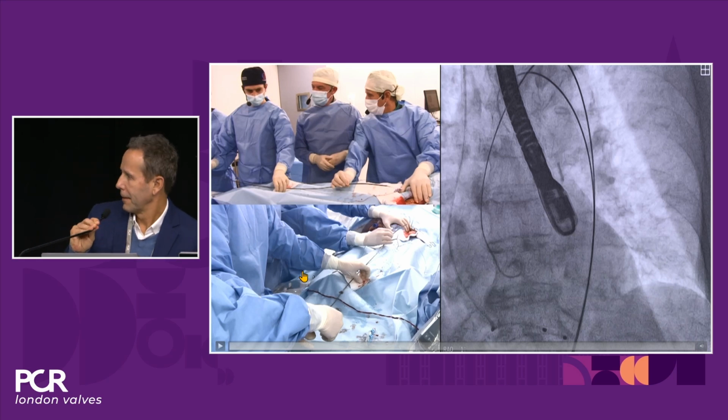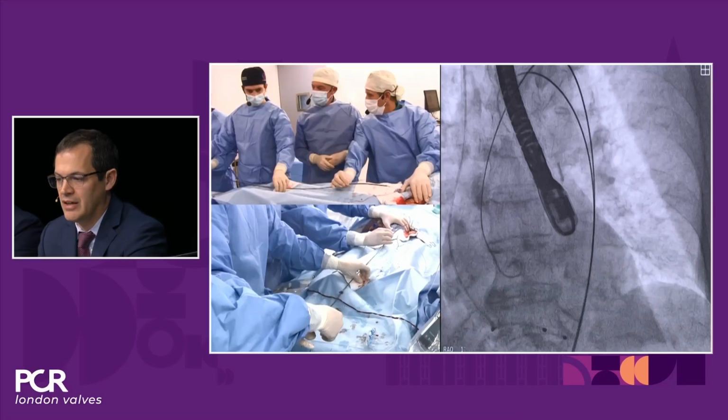So, yeah, fantastic. Maybe we'll pause there for a second as you've introduced the case. I think we would all agree it's a high-risk patient, an elderly woman, very heavily calcified valve, advanced renal dysfunction. She has risk of stroke, as well as obviously acute kidney injury. I like the fact that you've emphasized the use of the TE and other methods to help guide the procedure.